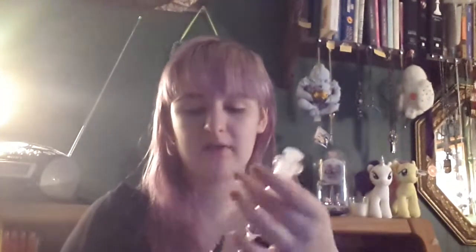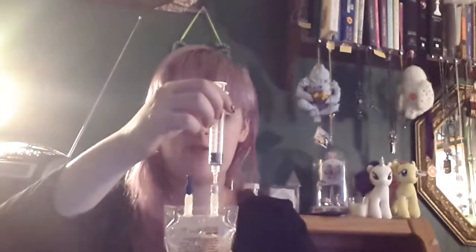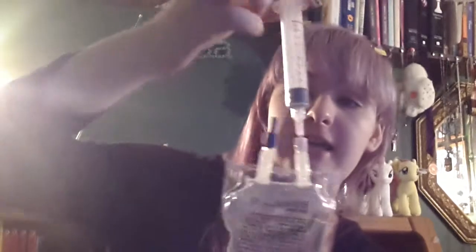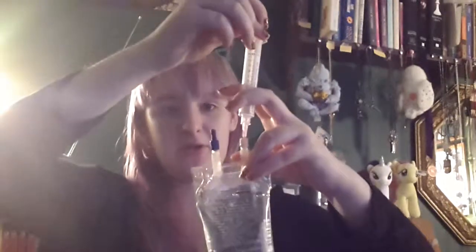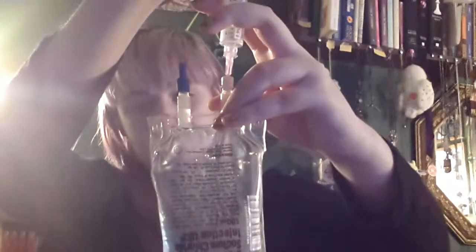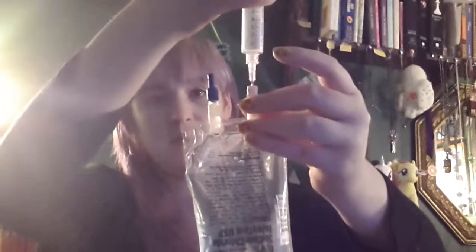A good thing to do with this — which you don't have to worry about with the VioMate, which is nice — you do want to remove the air. If it's a pre-mixed bag, you just have to be careful, like I explained in my video on how to prep the line. So you just want to take it and pull back on the syringe to remove the air. See how I'm removing the air right up to the tip here. Then you can just pull it out — it's just air, so you can release it.